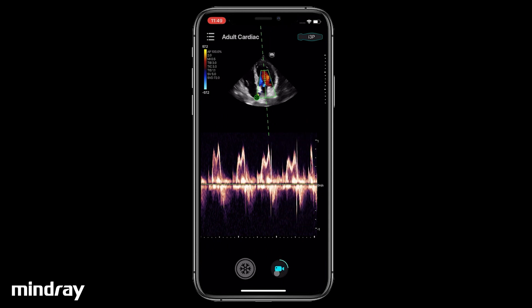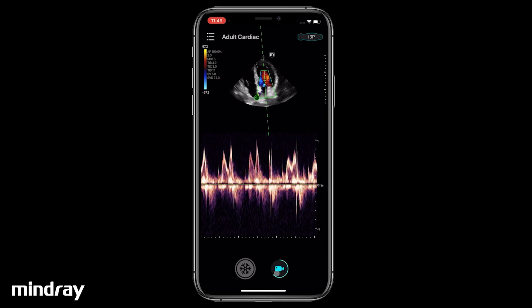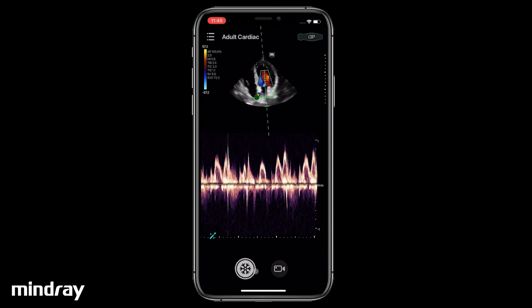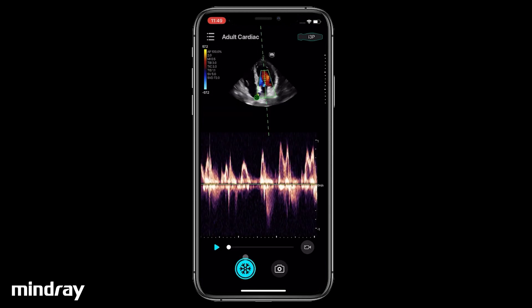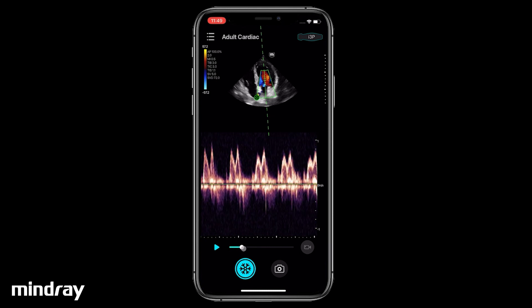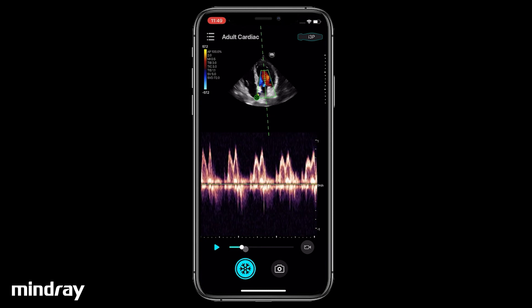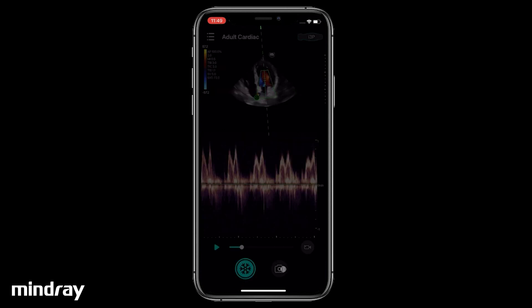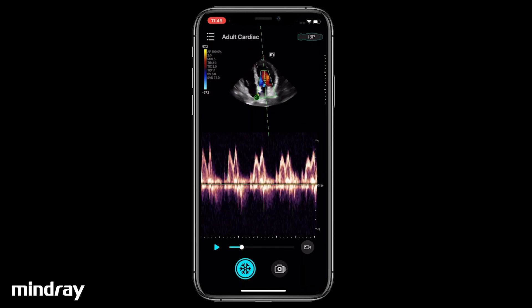Tap the Video Camera icon to save a Cine in real-time during scanning. After freezing, tap the Play button or drag the Progress bar to review the current Cine. Tap the Video Camera icon to save a retrospective Cine. Tap the Camera icon to save a still image.